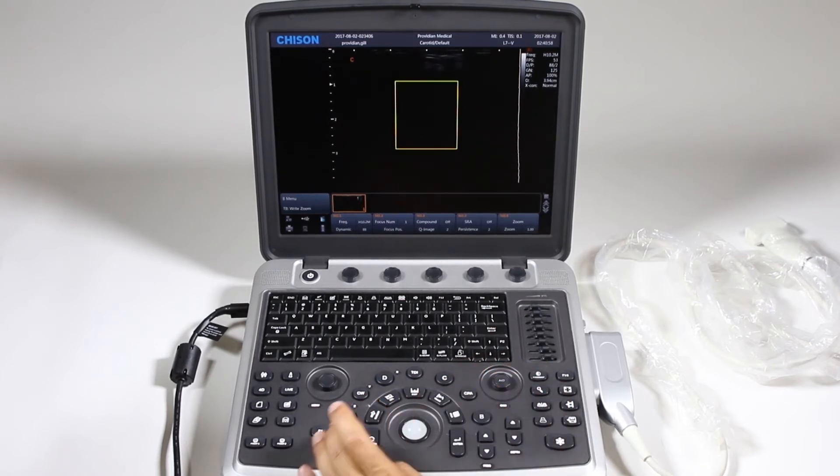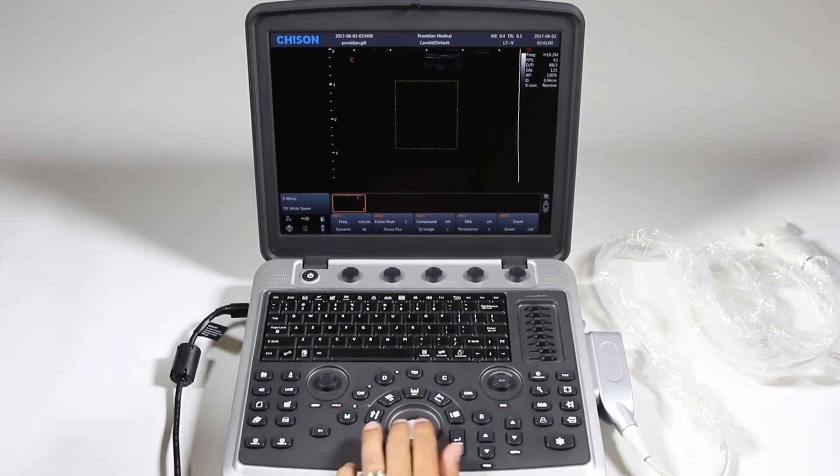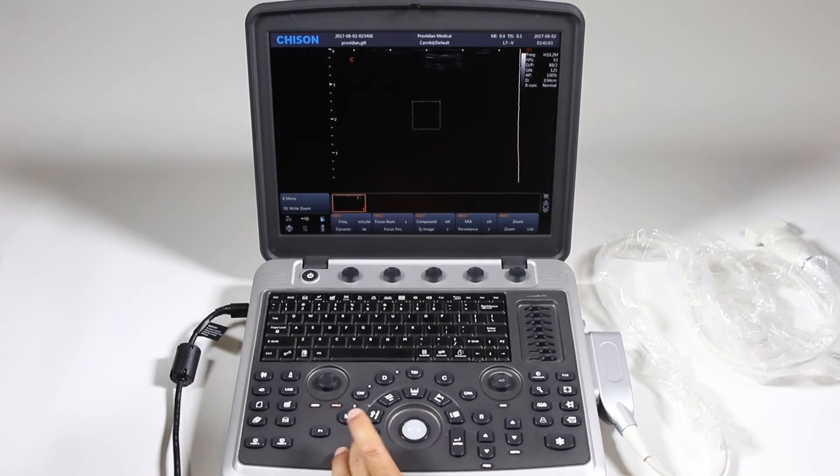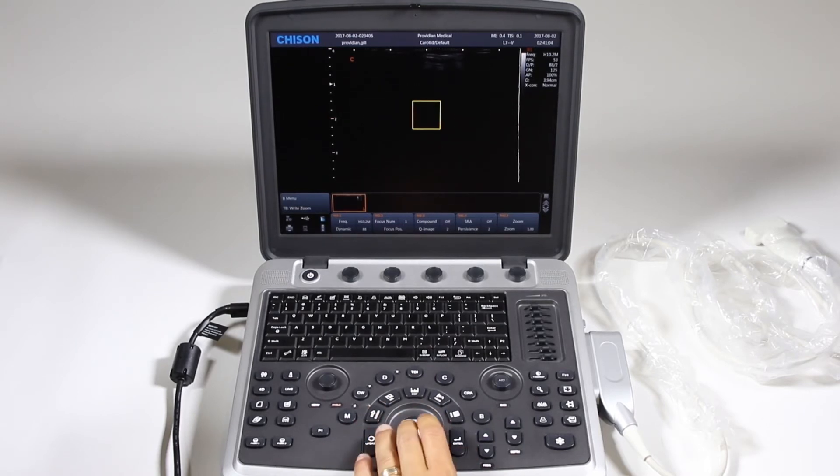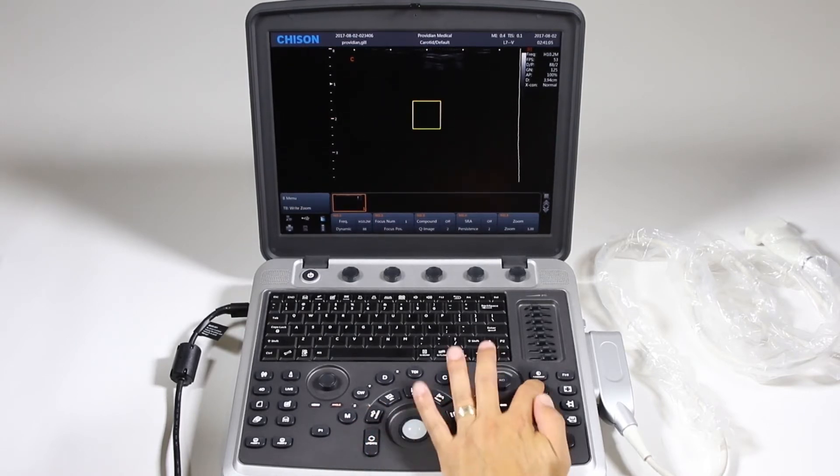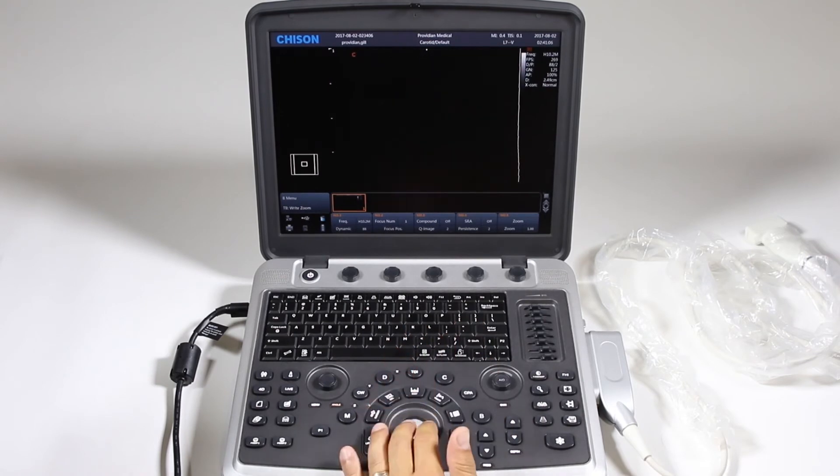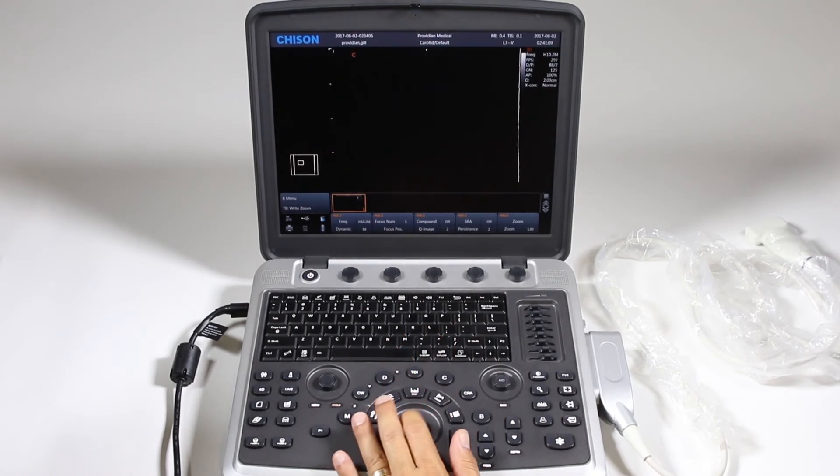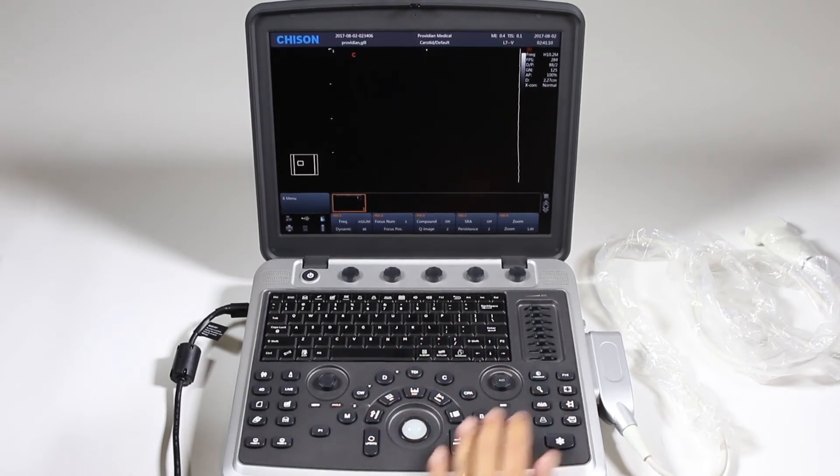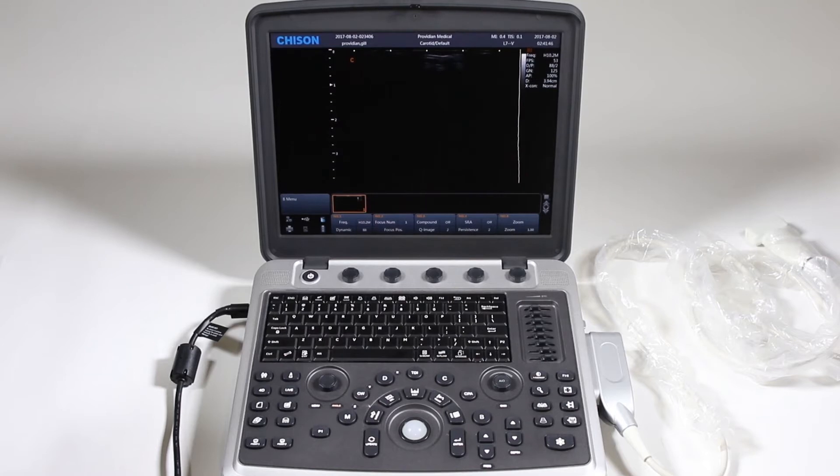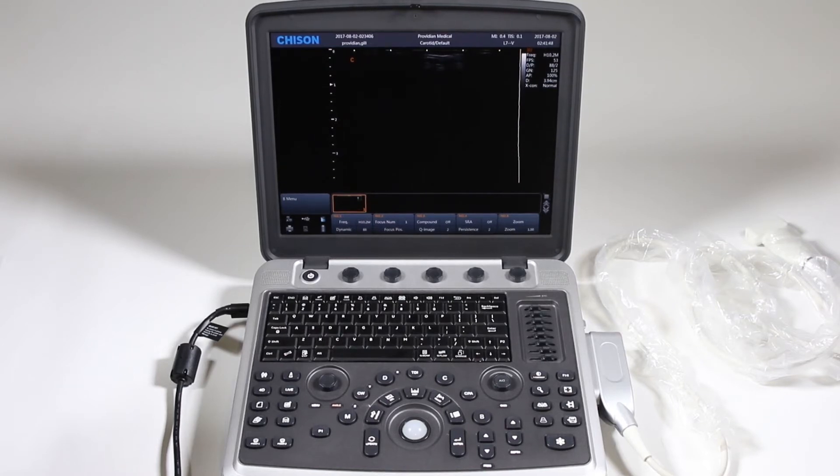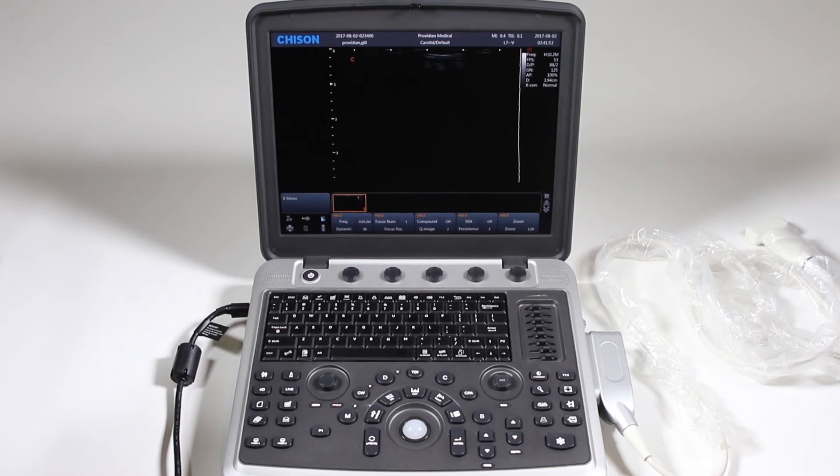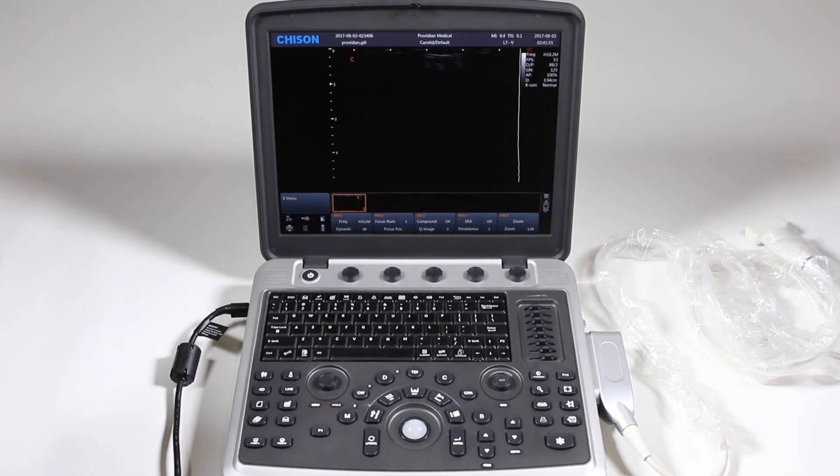If I click this zoom box, I can also use the update key, change the size of the zoom box. Click again, press the magnifying glass, and now I'm zooming in on that area. Some other items for image optimization, where you would start normally with the frequency, dynamic range, compound imaging, etc.